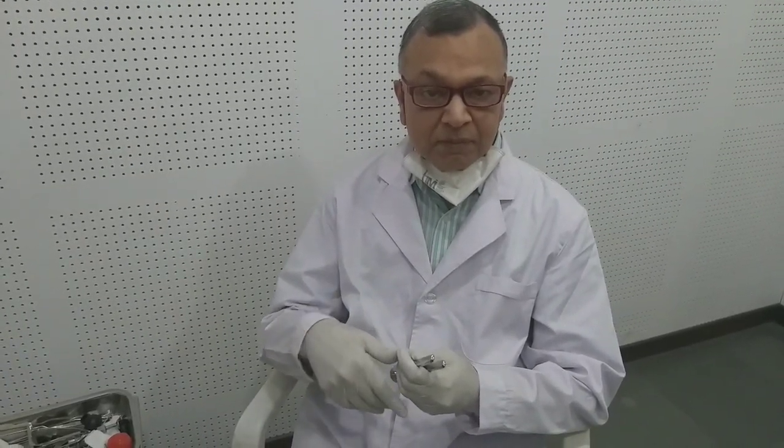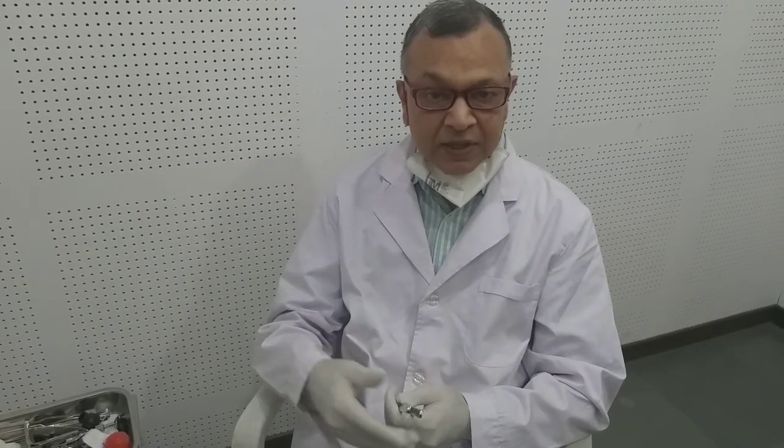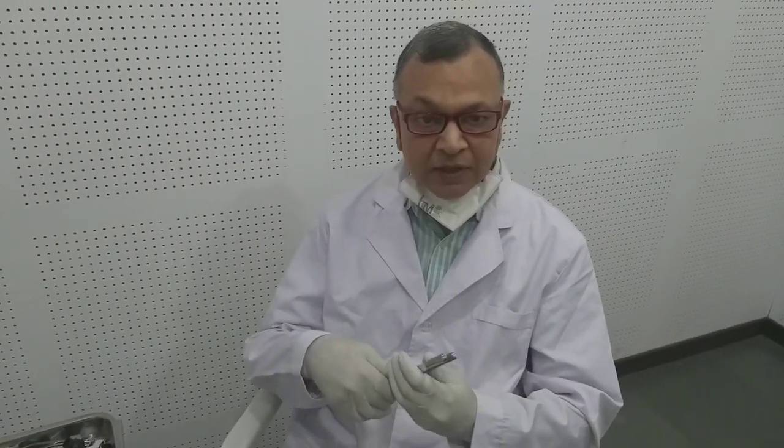If the Rinne's is negative, it means bone conduction is better than air conduction. If Rinne's is positive, it means air conduction is better than bone conduction. So if bone conduction is better than air conduction, the patient has conductive hearing loss. In conductive hearing loss, the patient will have pathology in the external auditory canal, tympanic membrane, or middle ear. If the patient is having pathology of the cochlea or beyond — at the eighth nerve — that is called sensorineural hearing loss. In sensorineural hearing loss, ABC will be reduced.